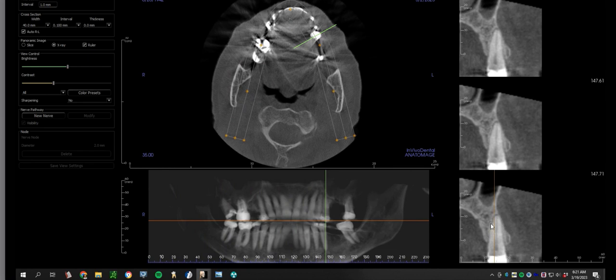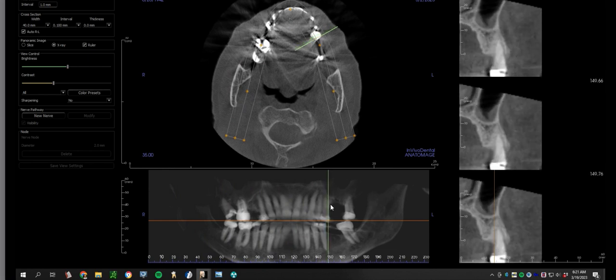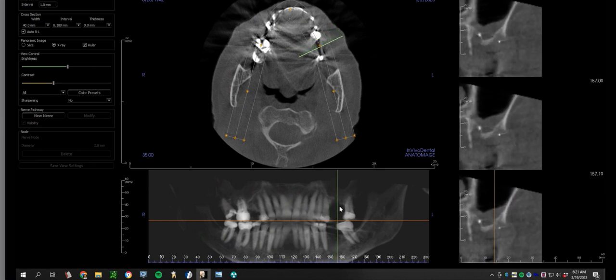I would assume that some teeth, or maybe at least one tooth, is getting overloaded, and that's potentially what we're seeing. This is the kind of thing we see when a patient has active ortho or recent orthodontic treatment. So just put some special attention that this tooth is probably getting overloaded biomechanically. So then we come over to the recent extraction site.